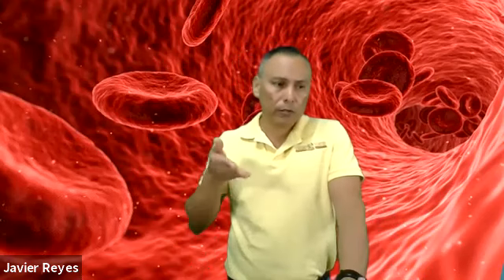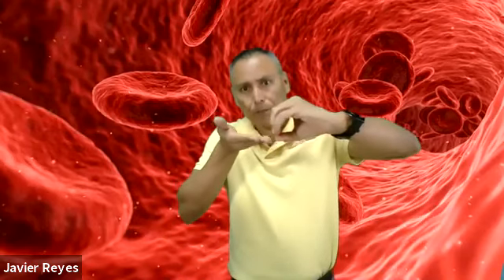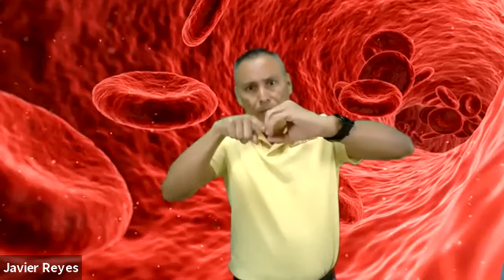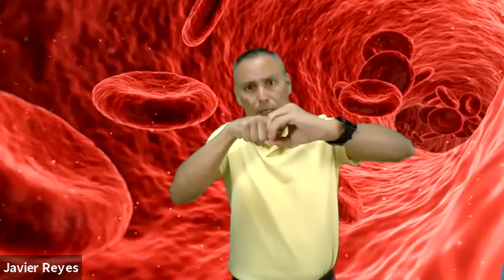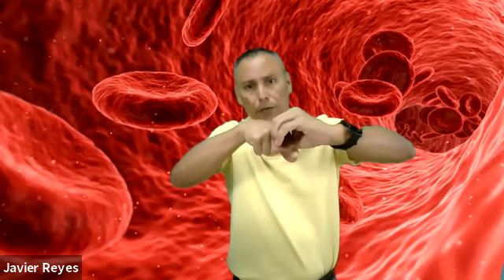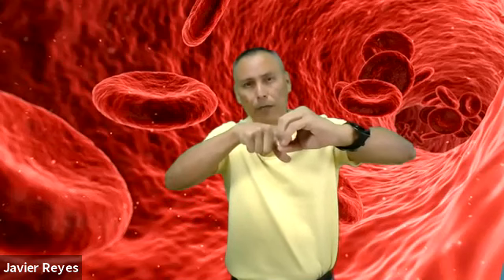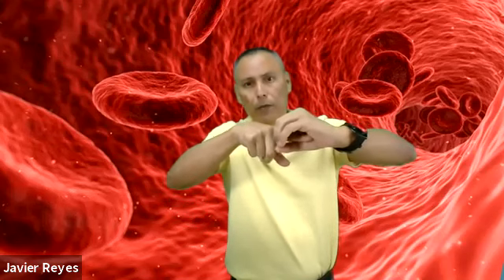So when you insert the needle, you can only imagine. Okay, say this is the vein, and the needle goes in. Sometimes the bevel may be partially in, sometimes maybe all the way through. You retract the needle and come back into the vein, and you might get blood draw. Sometimes you go right through it, through the side. Okay, so just take a step back and evaluate the process, and make the correction if needed.